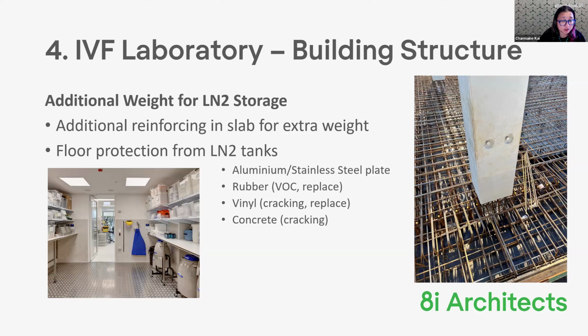So a lot of times the rubber flooring is in tile form, so you could actually take it out and replace it if it cracks. Vinyl floors, really common in Australia. Most tank rooms have vinyl floors because it's cheap. It is prone to cracking and it needs replacement.